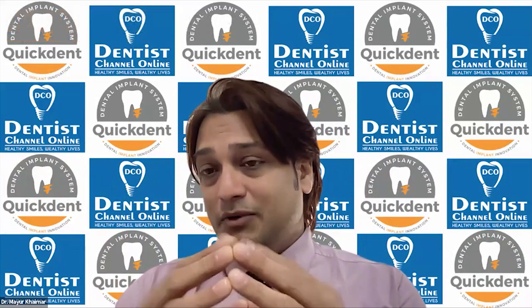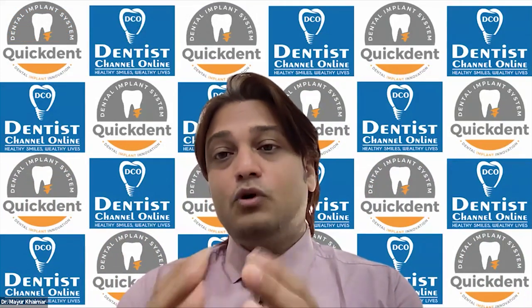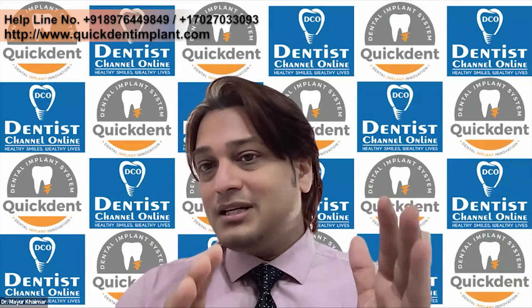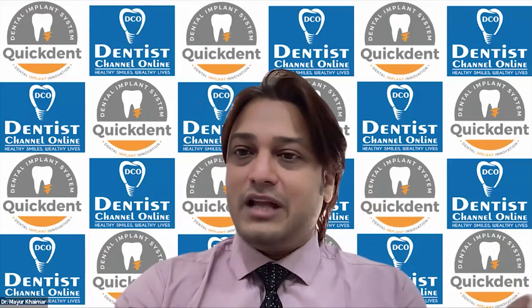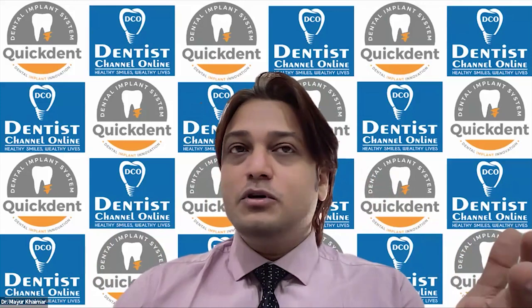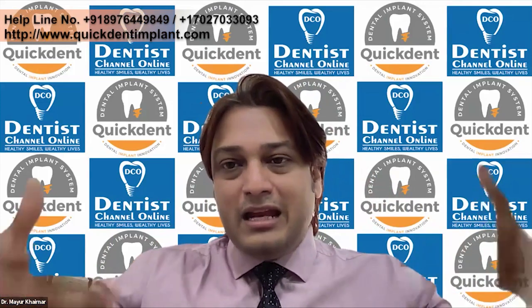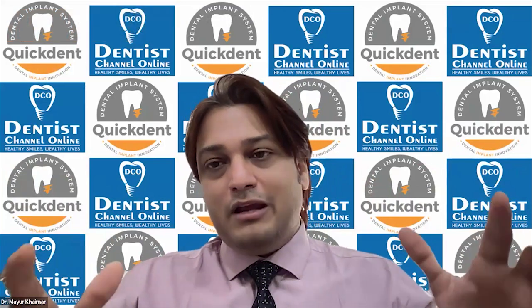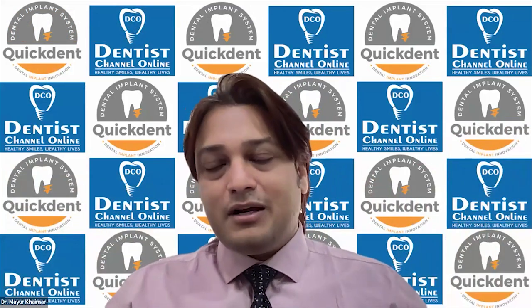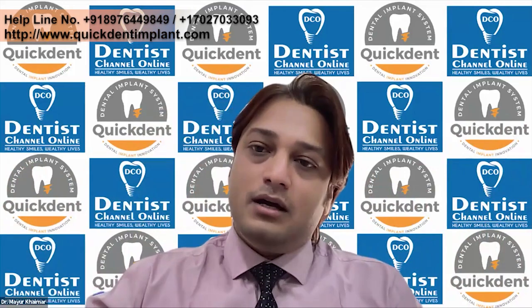The only disadvantage of the hybrid is that if it is not well polished, it can stain comparatively more than the PFM. That's why I always say, whenever possible, PFM is the gold standard, and then you should go for these lightweight options. Why lightweight options? Because they will not induce weight. Any heavy weight itself acts as a force on the implant. So whenever the bone is resorbed, go for a lightweight one. But the disadvantage of lightweight is that it may stain comparatively more than the PFM.